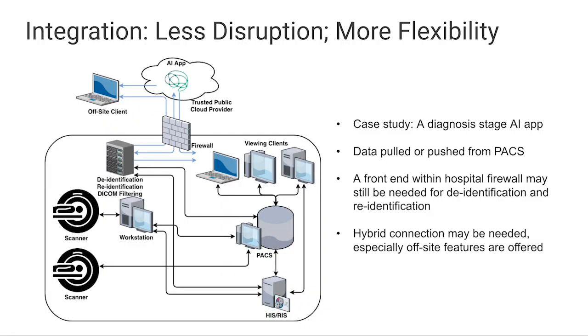As you see in this diagram, because of that, there are a lot more connections that need to be established, and a lot more connections going through the hospital firewall. That adds a little bit of burden on the IT staff. And also from the app builder's point of view, you need to consider that any of these connections need to be very well secured. So let's talk about efficiency.